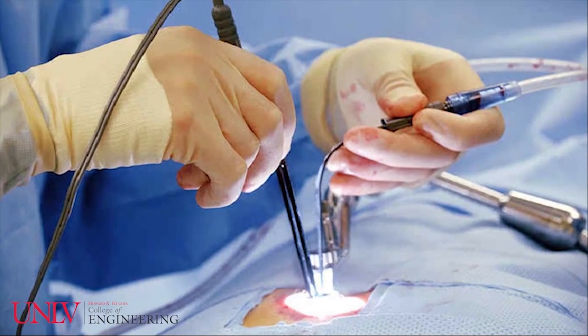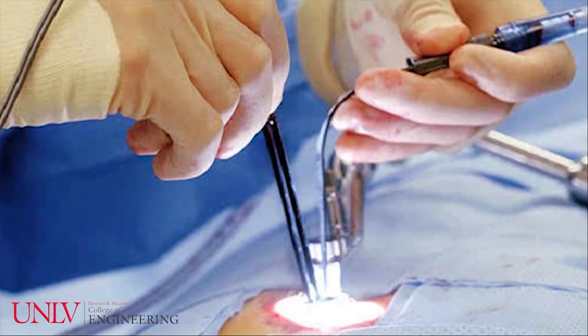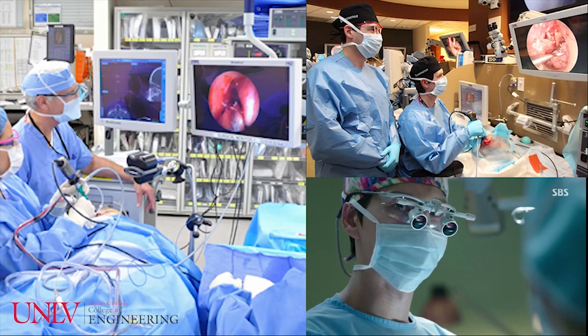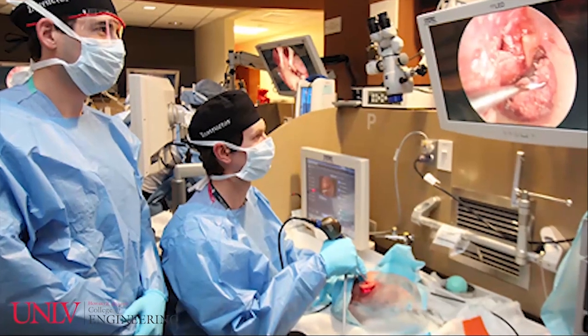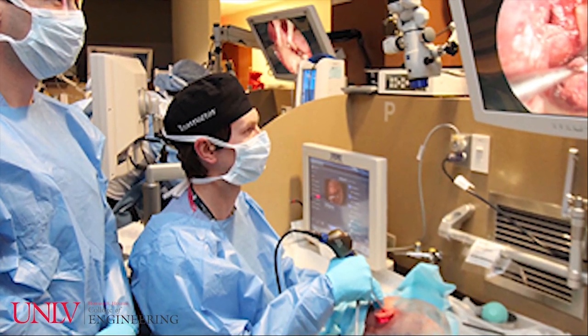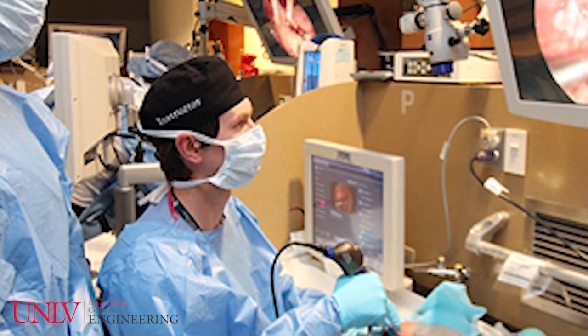In modern medicine, surgeries that are as minimally invasive as possible require the use of an endoscopic microscope. These microscopes are handheld devices that output their image onto a screen that the surgeon and their assistants can then view. The length of time these surgeries can last varies from 1 to 12 hours, depending on the complexity of the operation.